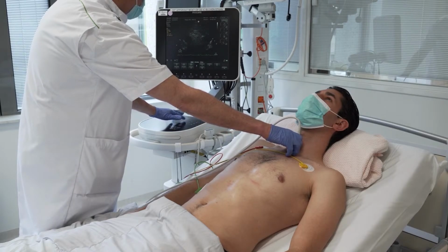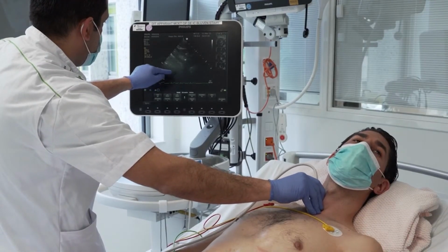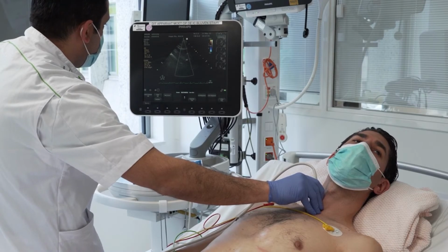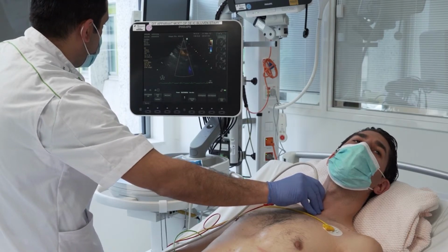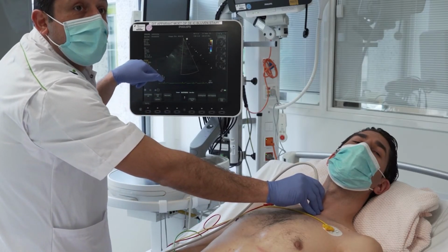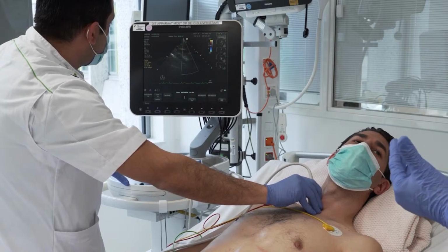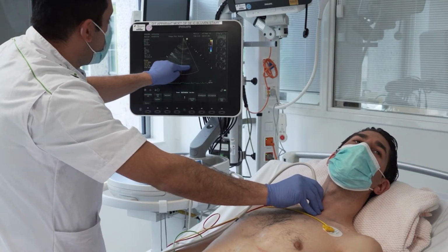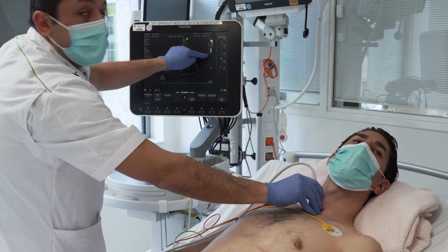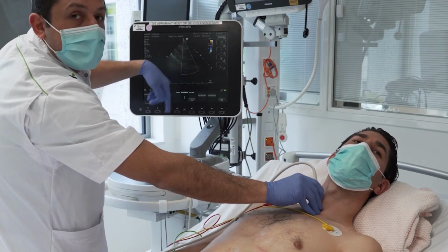I'm playing with my gain now. So we are trying to find the aortic arch with the suprasternal view. Sometimes it can help to put the color Doppler on it and follow the colors. And you can see the descending aorta, the blue color far from your echo probe, which is blood going away from you.